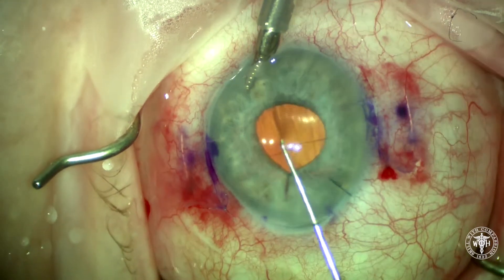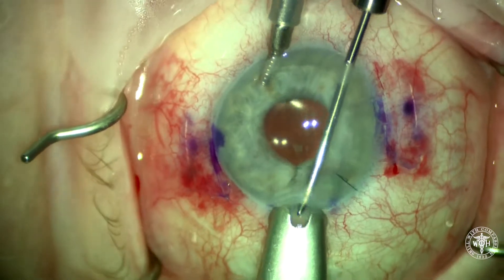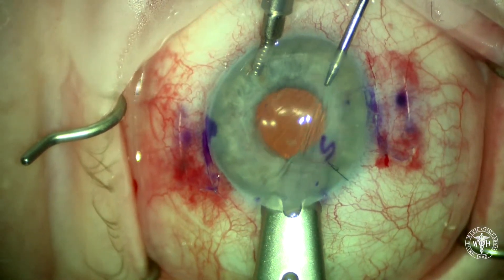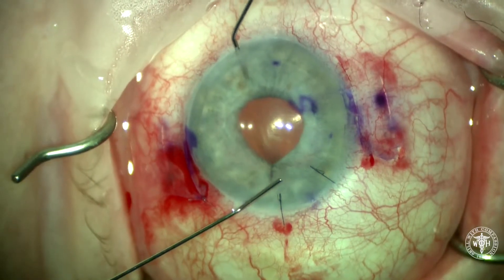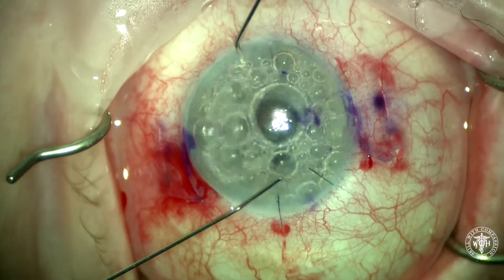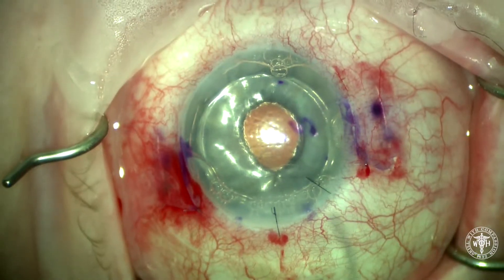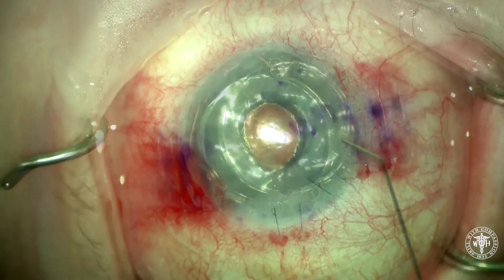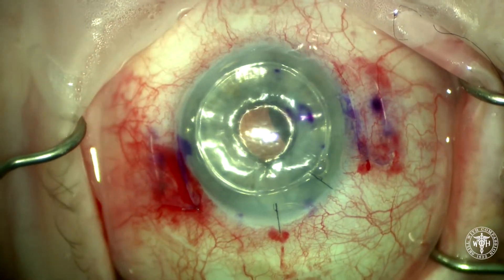This is stripping Descemet's membrane. Here I'm stripping under balanced salt solution — I typically will use viscoelastic, but here I chose BSS. The endothelial graft goes in smoothly with the help of a glide, and after a suture or two, we'll carefully inflate the eye with air, displacing the graft up against the posterior stromal surface. And here we are at the end of the case. Thank you very much for watching.